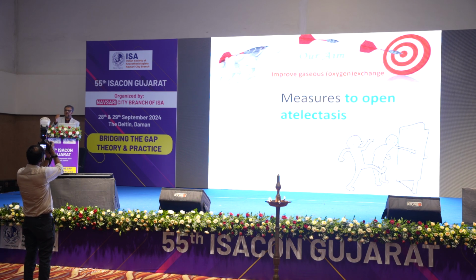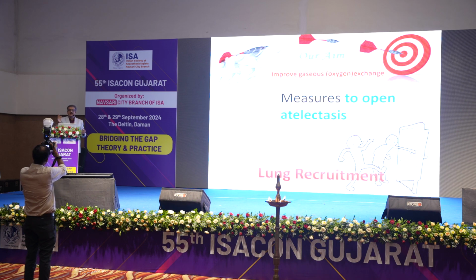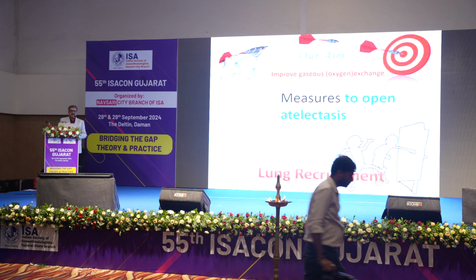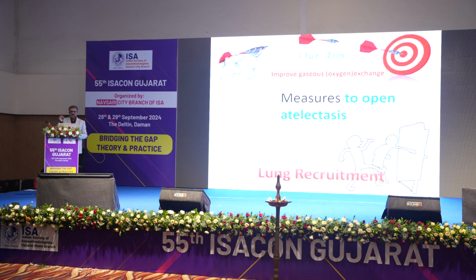But what about opening atelectasis? To open an atelectatic area, once it's there, requires high pressure. And that can be done by lung recruitment. Recruitment is a technique, a process, a mechanism to open atelectatic area, which requires high pressure.